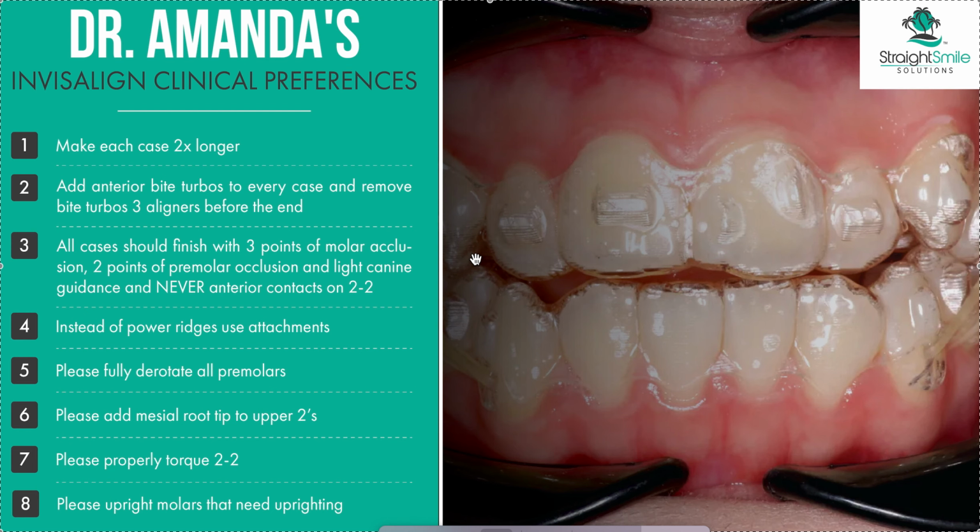At least it's not costing me anything, it's just my time, right? If you're using Lite, Moderate, or Go, it's going to cost you something, and you're not going to be happy about this, and the patient's not going to be happy, and you're going to be losing money on that case. That's why I think Go is the stupidest idea, not to mention the outcomes are ugly, in my opinion. I keep saying in my opinion, but why do they not offer Go to orthodontists? Because the outcomes aren't good, because you can't make good outcomes when you only move teeth within their limitations. It just doesn't look good, right? So we don't have Go because it's not good. It's lazy and sloppy, and it never turns out well. Anyways, all that was my opinion.